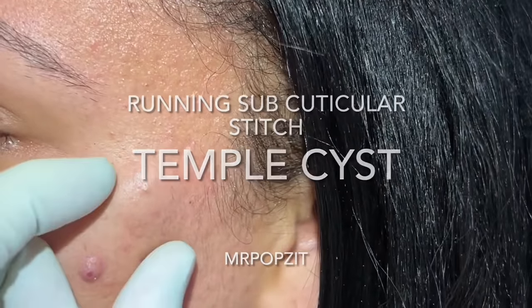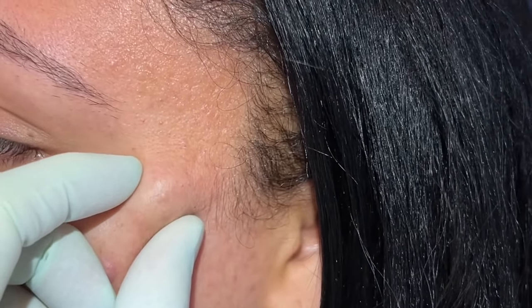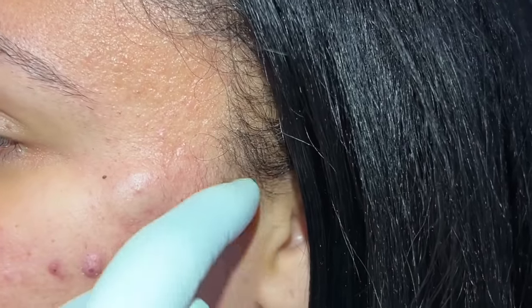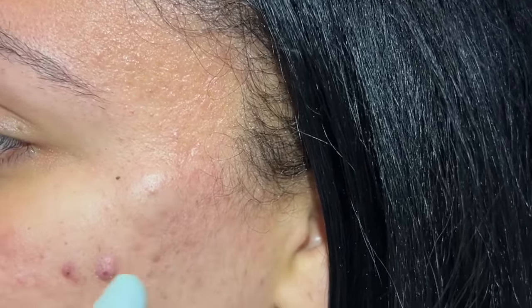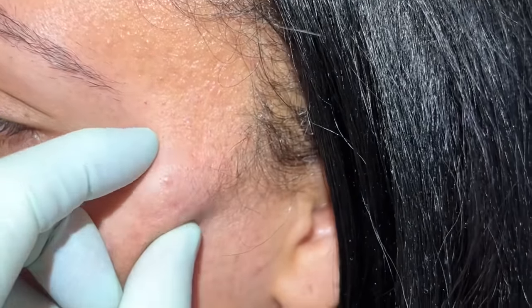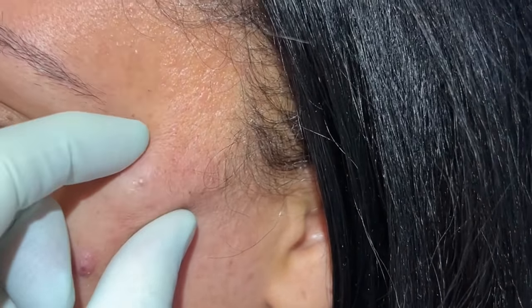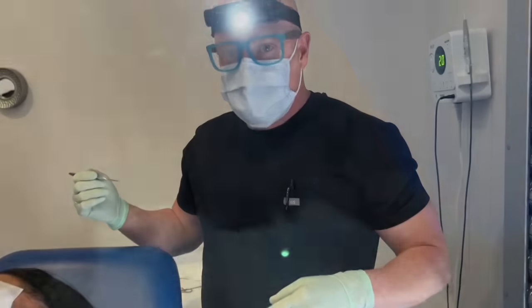Okay guys, Mr. Pops It here. We have a common occurrence — right off the zygomatic bone here we have an epidermal inclusion cyst, a little bit over two centimeters. You can see that little pore which is the punctum. We always watch for landmarks — a nerve that comes across, a facial nerve that comes up and down this way, and an artery. We're above all that. We're going to get her numb, mark the outline, make just a tiny cut. If the skin's thick enough we'll likely do a running subcuticular buried stitch so she has nothing on top.